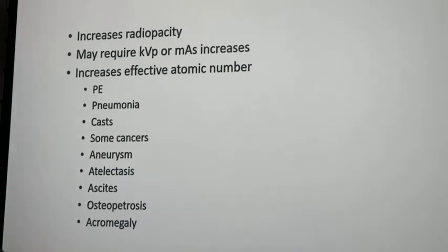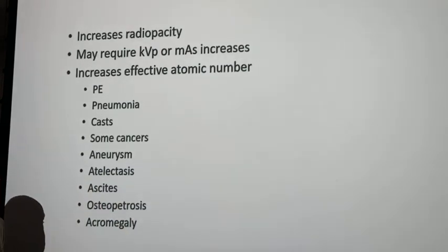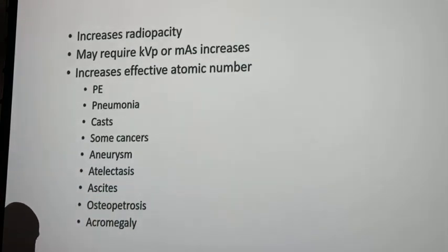What about casting material? Casting material is complicated. What'd you start saying? Somebody? I was going to say you increase kVp. Well, it depends. It depends. And we've got two different types of casting material. We've got plaster cast, which is hard to get through. And then we've got fiberglass, right?